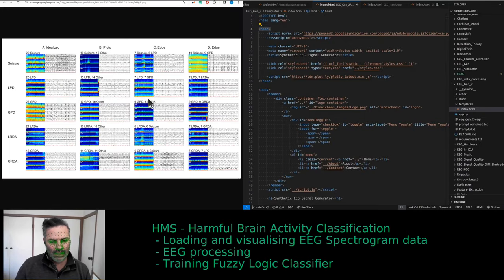Yeah, back to that competition for a second. We do have the data, so I'm kind of familiar with what the data is doing. But this figure is quite useful in the sense of describing the data set. So I have these different types of edge cases. In this case, those are the labels. This is supposedly 10 minute EEG, for which you actually do not have the raw EEG, you only have the spectrogram and some 50 second samples of the raw EEG.